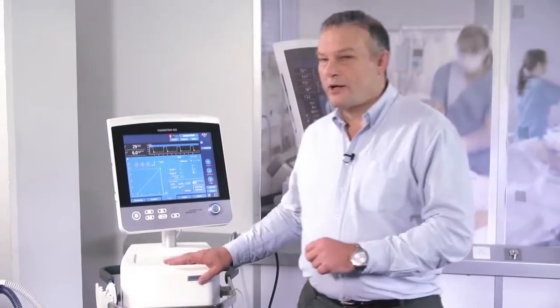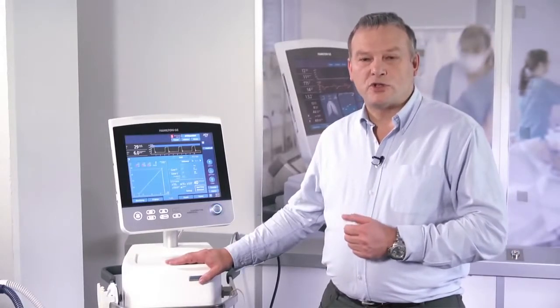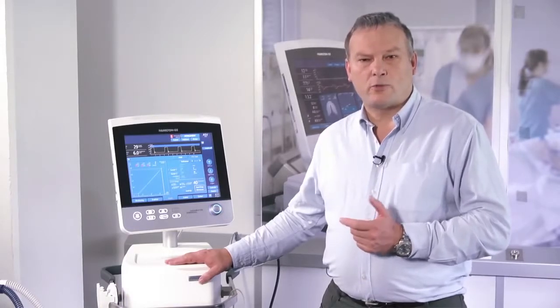Hi, I'm Ross Freeburn. I'm an intensive care specialist from Hawke's Bay in New Zealand. We've been using the Hamilton ventilators for about 10 years and I wanted to show you today the PV tool, which is a tool that Hamilton have developed on their ventilators and which we've found quite useful for clinical practice.